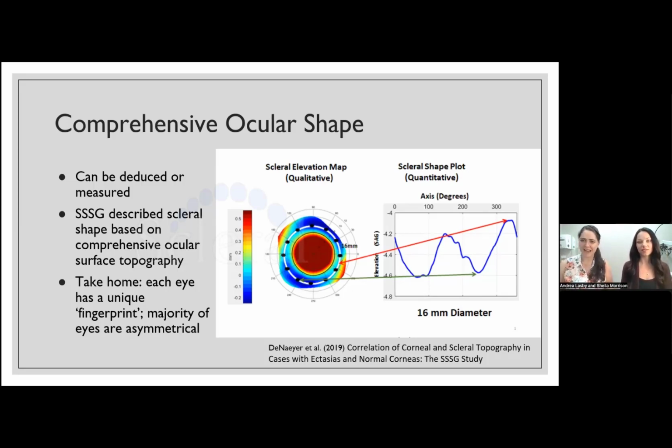Like, what do you mean? How are you getting that much? This should be maybe 20%. And I was like, well, what am I doing wrong? I'm just a lowly resident. I'm going to say something that probably never changed just because she's a perfectionist with fitting. So those edges, you probably had smears on people in those days and then you didn't like it. Yeah, maybe. I don't love a lot of posterior lens debris when you see all that tear exchange, which we'll get into in a minute. And so I went to torics right away.